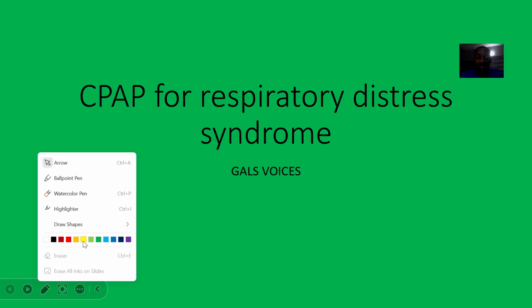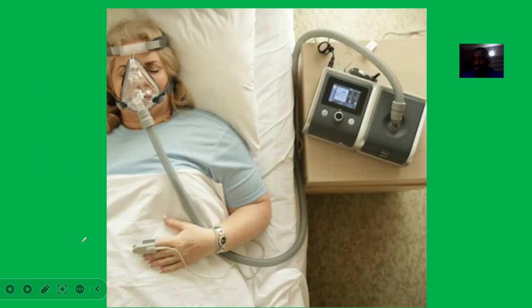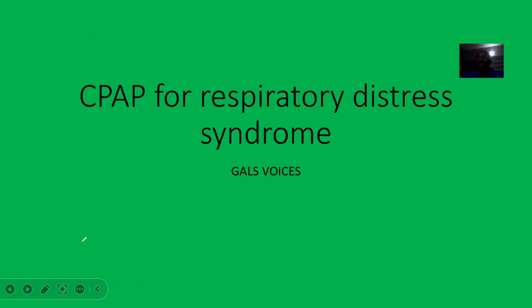So we are looking at continuous positive airway pressure. You can actually employ this for respiratory distress syndrome, in newborns that have respiratory distress syndrome, or in older children, or adults that have issues with breathing.